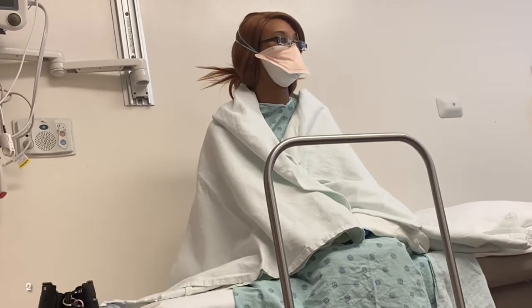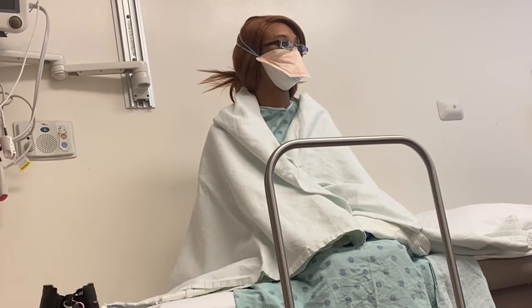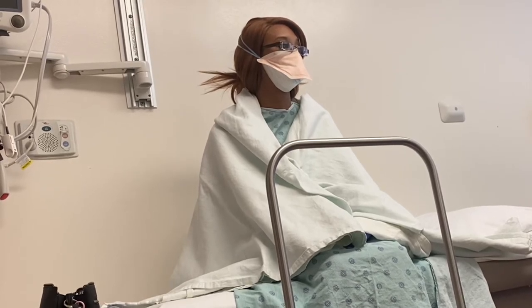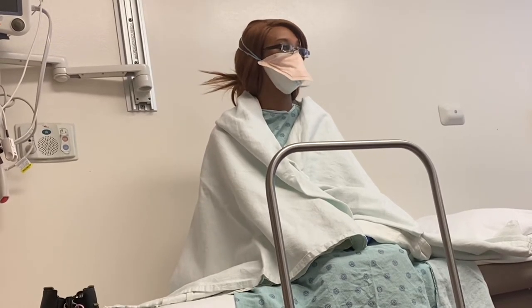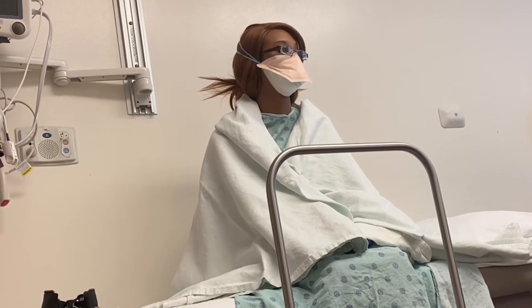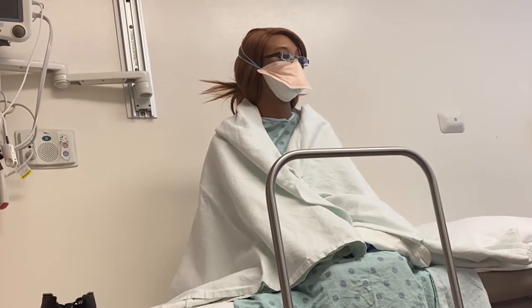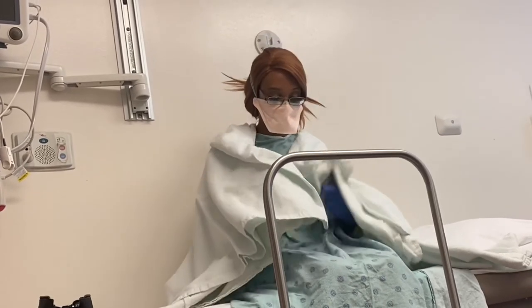Yes. So the overnight tube is called a 24-hour impedance. And with that, another tube is put in your nose, goes down to the stomach, visible, go home with it, is connected to a monitor, and it's looking for reflux overnight. And on the monitor, there are buttons you press when you eat, when you lie down, and when you have symptoms, okay? Let me see your sheet. Yeah, you got chest pain.